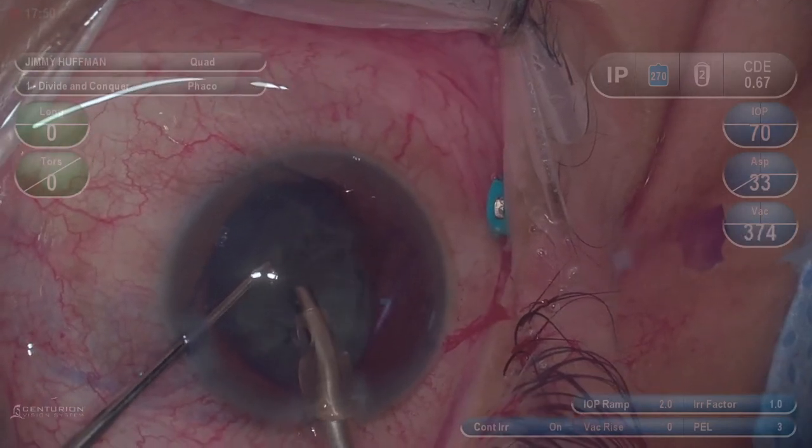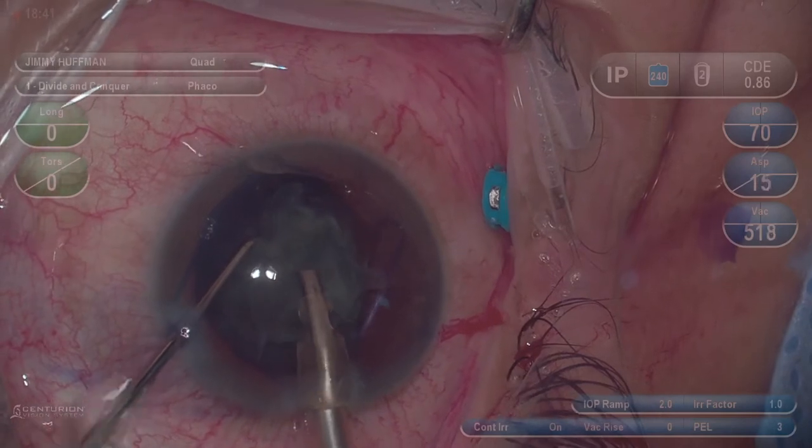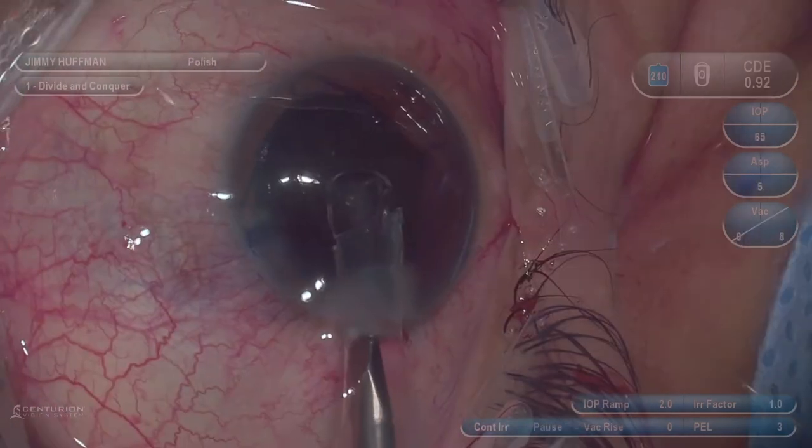With this video, I really want to highlight the versatility of the Ingenuity system and how it works with both the state-of-the-art Alcon FACO and vitrectomy system.